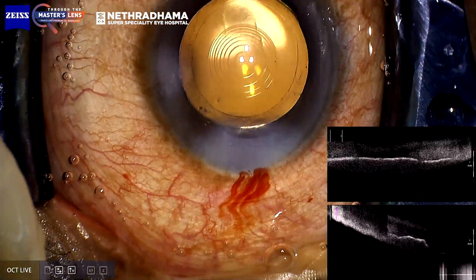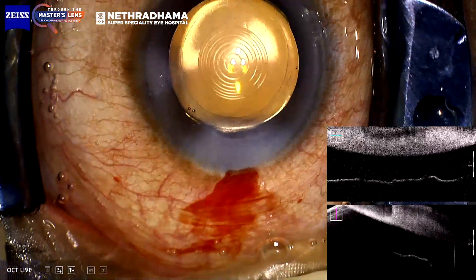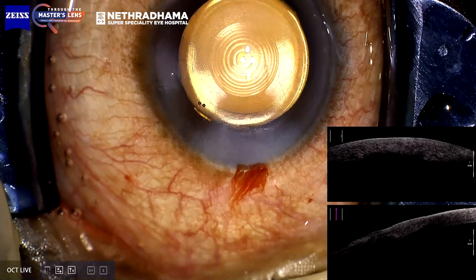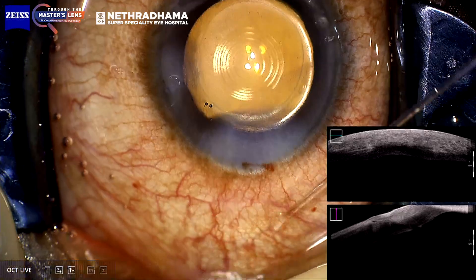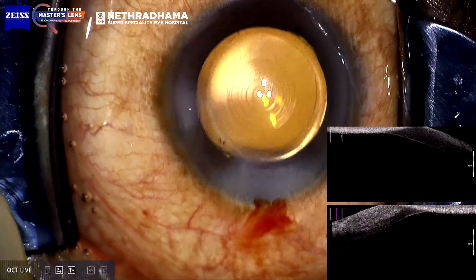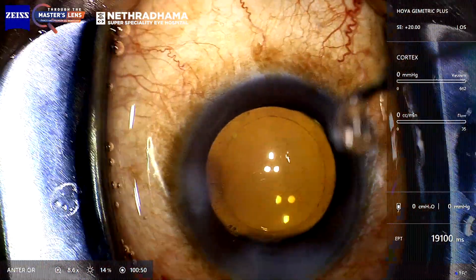Now we'll look at the OCT to clarify the query about the wound. I created it as a triplanar wound with the blade. You can see on the OCT — there is no gape, even the internal lip is perfectly sealed, so even if you stood on this eye it's not going to open. Since I have not used bimanual IA, the side ports are not stretched. The lens is perfectly centered, the wound is very stable, and the AC is well formed. That's the end of the surgery — thank you very much.